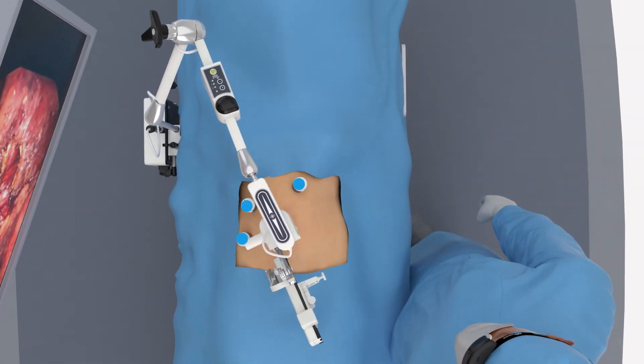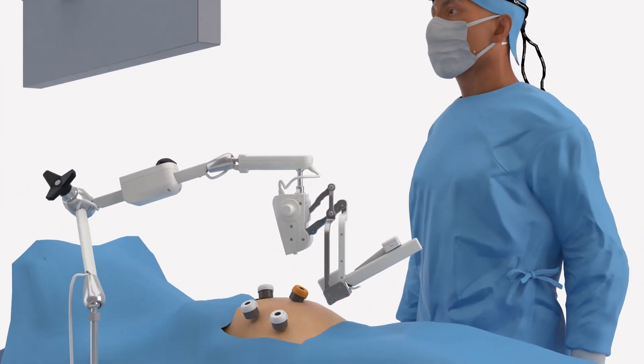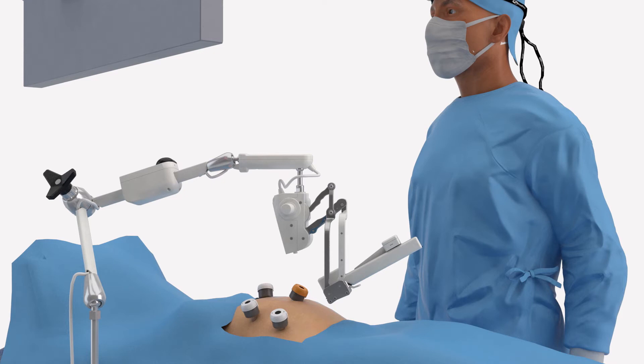The operating ports are well spaced from the arm, allowing for the necessary manipulation of the surgical instruments. The surgeon is positioned opposite to the monitor screen where the indicator unit is placed. This gives a clear line of sight for communication between the surgeon and the freehand cobot. The freehand arm is set at the correct height for both patient size and surgery type, allowing optimal movement of the scope and instruments.